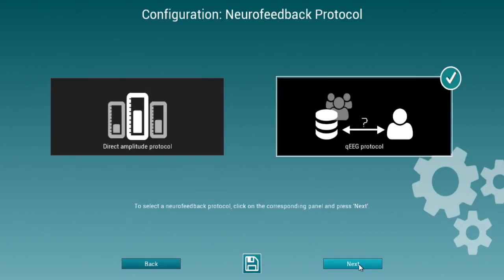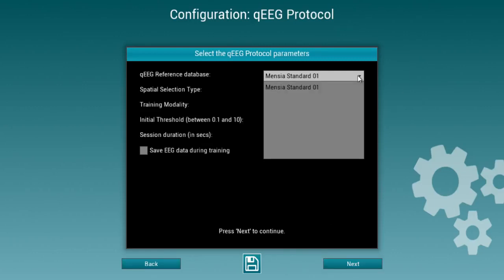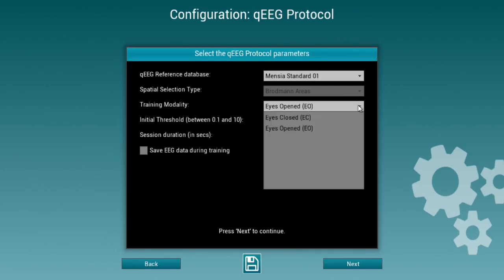Neuro-RT Training offers you the choice between two types of neurofeedback protocols: direct amplitude protocols or QEEG protocols. If you want to do QEEG protocols, you'll have first to select a reference database. This normative database can either be selected from those available or built by yourself after you collect data with your EEG headset. Once you've done so, you can either do roadmap areas or surface data. The modality can be either eyes open or eyes closed, as databases would usually handle both.